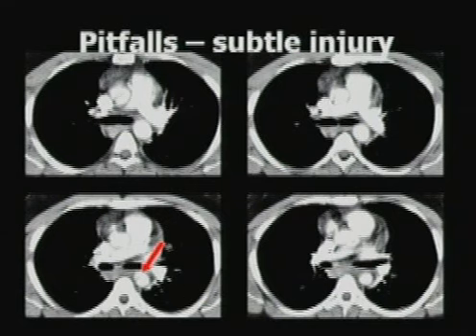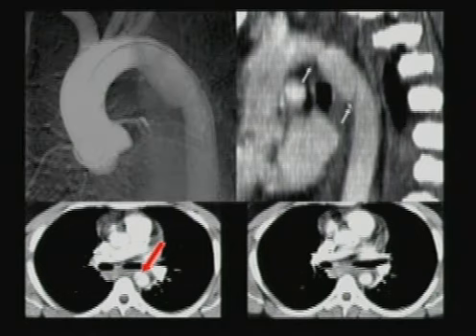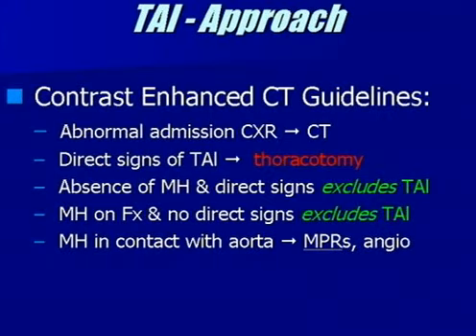I'm picking out the easy images now. There is an intimal flap that we can see at the bottom end of a very subtle pseudoaneurysm, and perhaps this isn't quite perfectly round over here. But one tool that was not done, which would have been very helpful, which I was able to do after the fact, was to do our oblique sagittal MPR. It shows a beautiful pseudoaneurysm, which is not well appreciated on the transverse images, and lo and behold, it looks very much like the angiographic example. So it's a very good problem-solving tool.